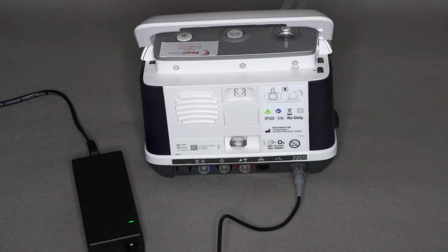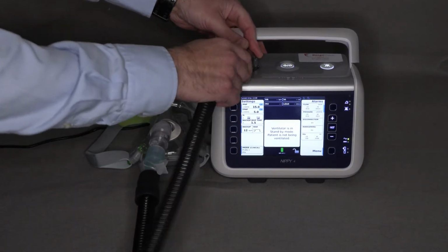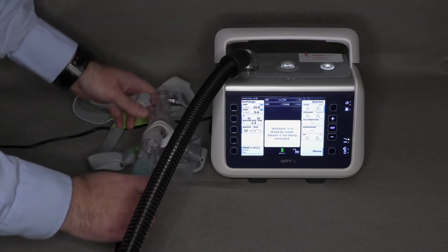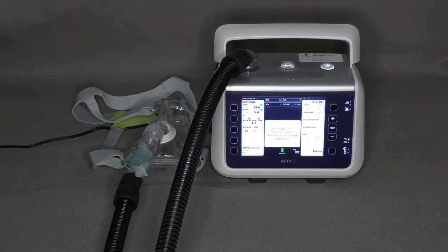Although Nippy 4 does have an internal battery that is kept charging once the ventilator is connected to electricity, it should always be operated from mains power to avoid running the battery down. Ensure that your breathing tube is connected to the outlet at the top of the ventilator and your mask is connected to the other end of the breathing tube. If the device is completely powered off, you'll need to turn it on into standby mode.